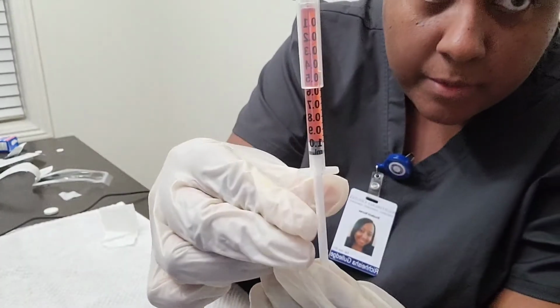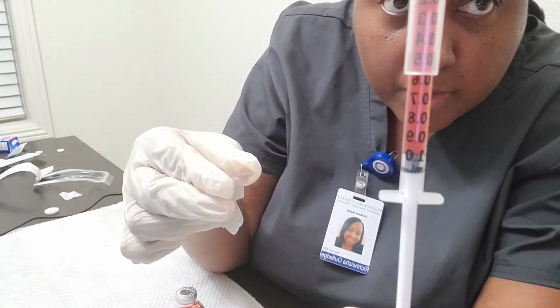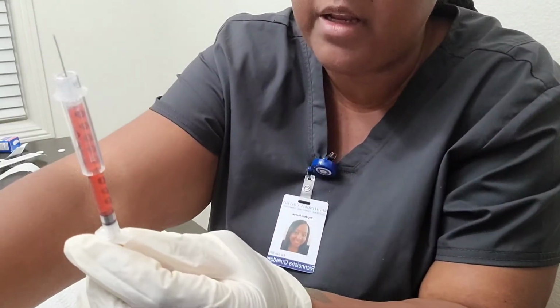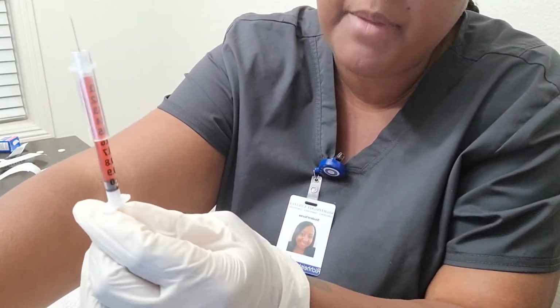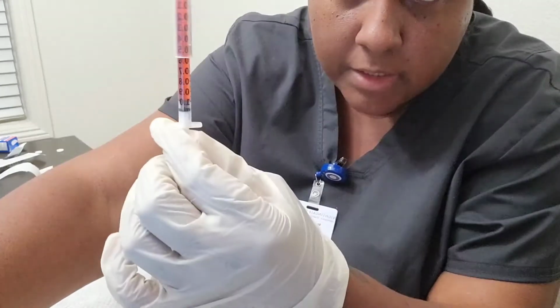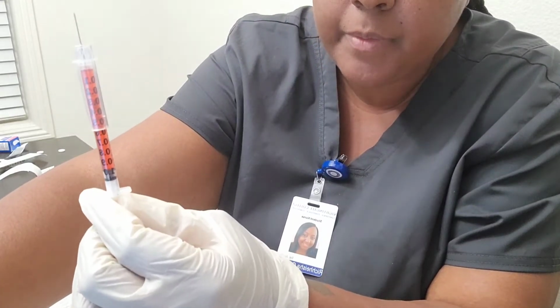You can see that. Okay, of heparin of one dose, which is 1 milliliter of medication, and the correct dose is 1 milliliter.